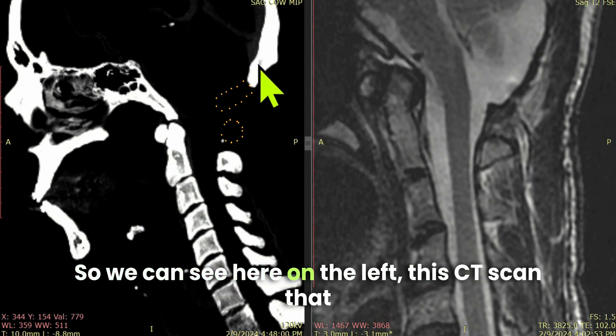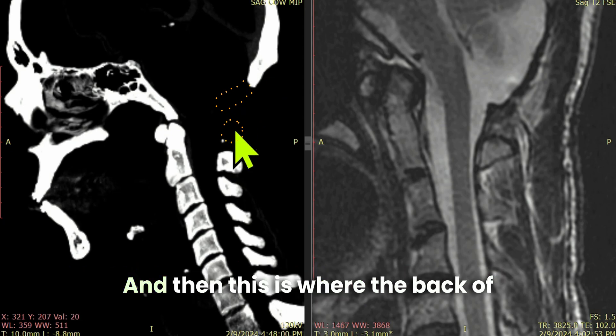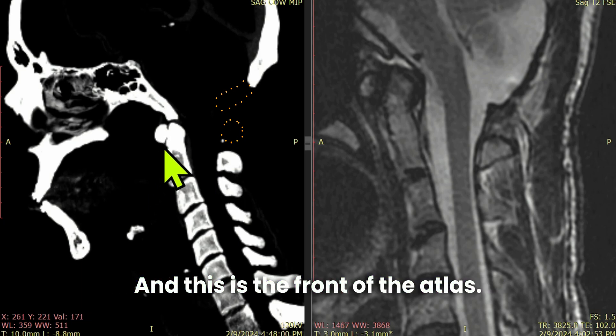We can see here on the left this CT scan that shows where the back of the skull should be, and then this is where the back of the atlas should be, but it's not there — and this is the front of the atlas.